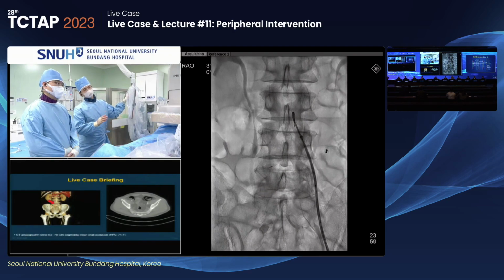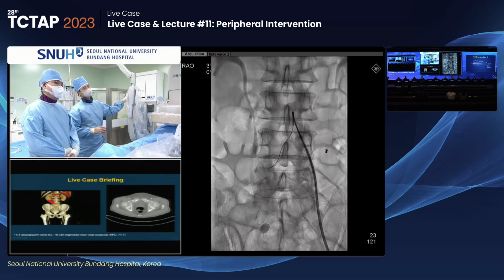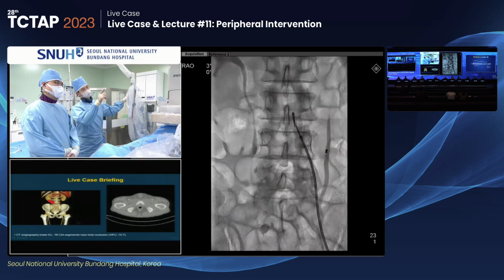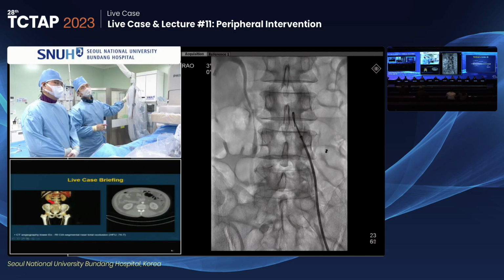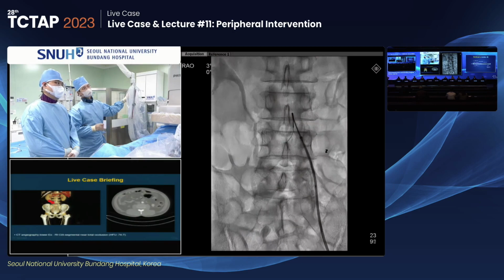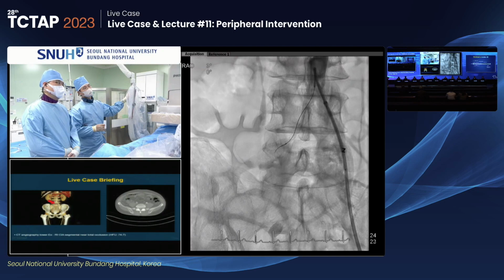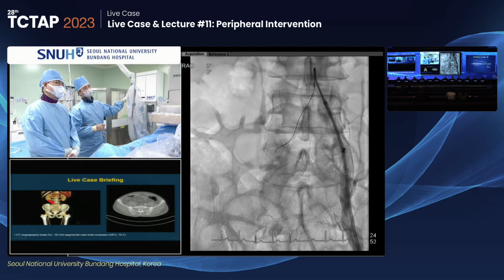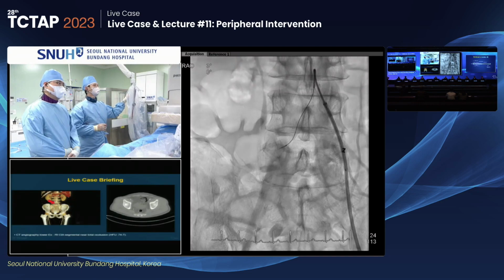But the disadvantage of this Omni catheter is there is a proximal loop of the catheter that makes the wire navigation harder. So I cannot navigate the wire tip, and it isn't in the true lumen.